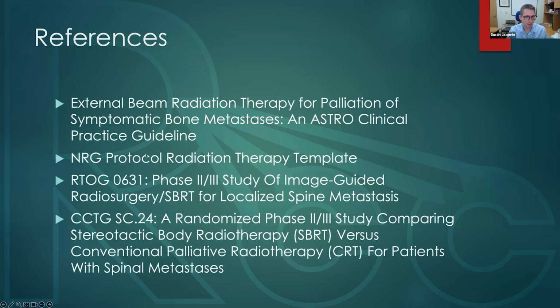NRG has a protocol for spine SBRT that they publish on their website, which is nice. And then, of course, these are 2 clinical trials that are really influential in spine SBRT planning.